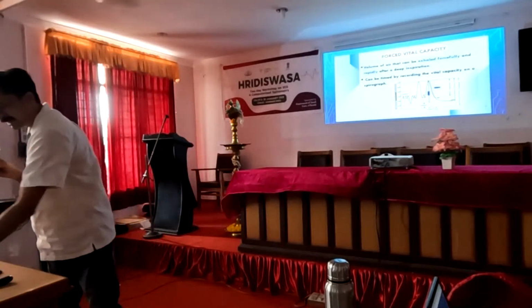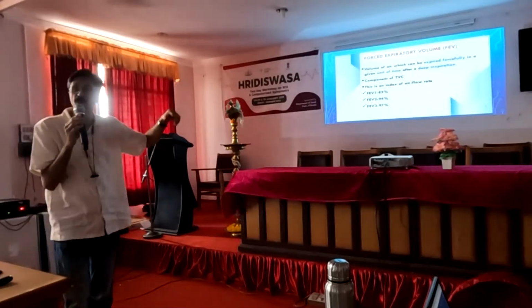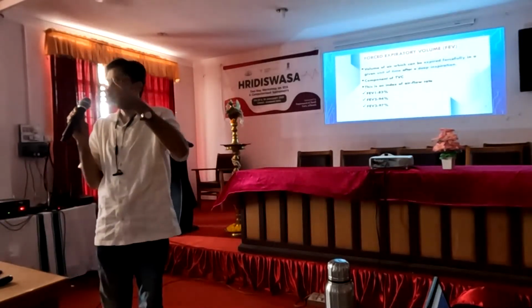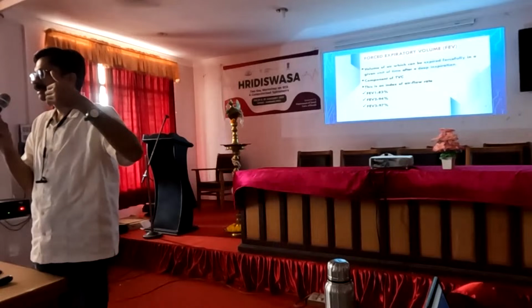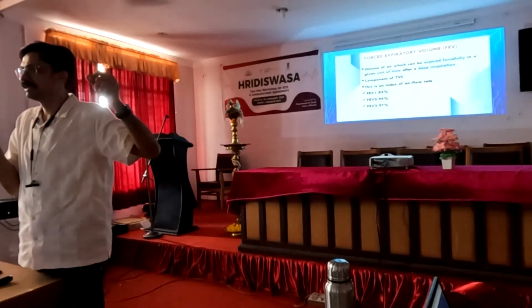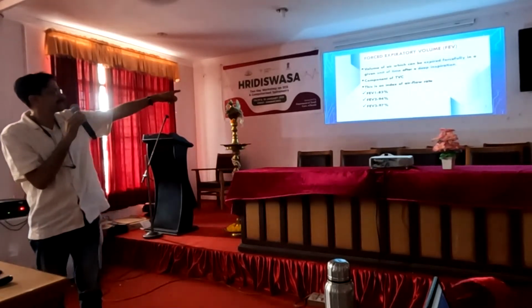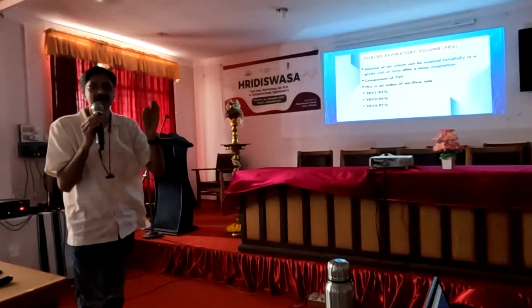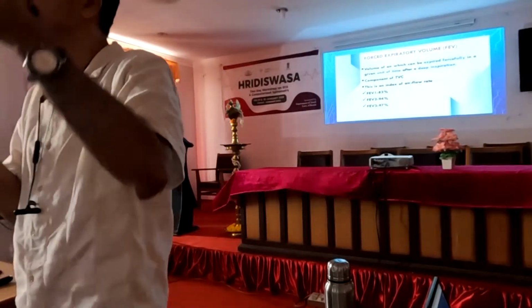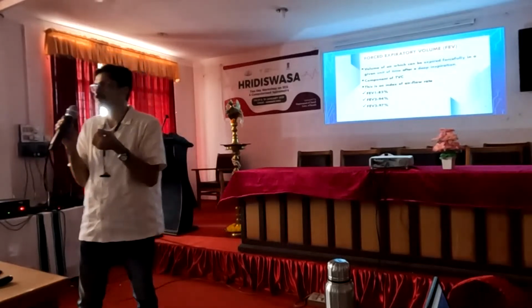Timed vital capacity has three components, which come under the forced expiratory volume. Here we are analyzing the airflow rate. Clear? Timed, and we are analyzing the airflow. That is the volume of air which can be expelled forcefully in a given unit of time after a deep inspiration. We are analyzing in the proper time: the first second, second second, and third second. We are analyzing the expiratory rate, its airflow.